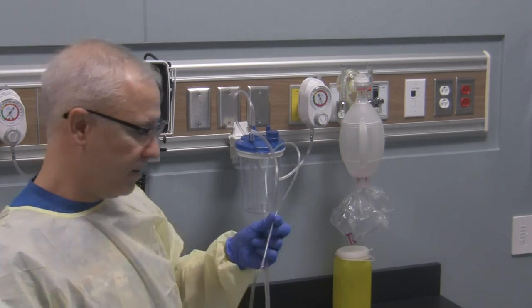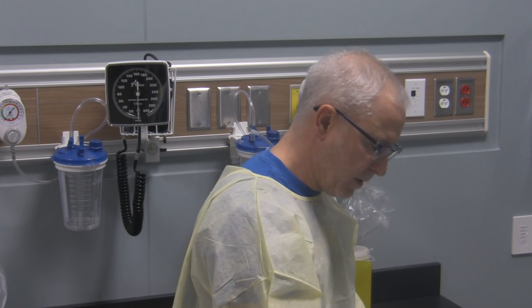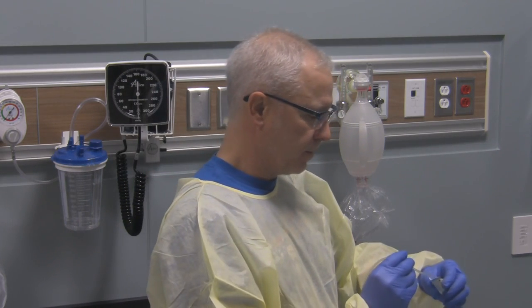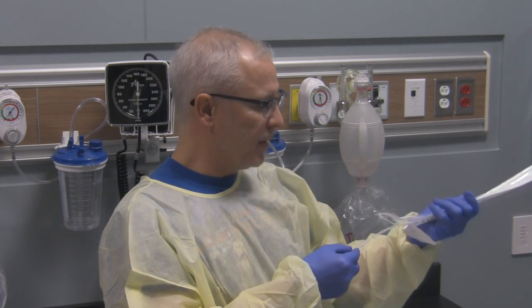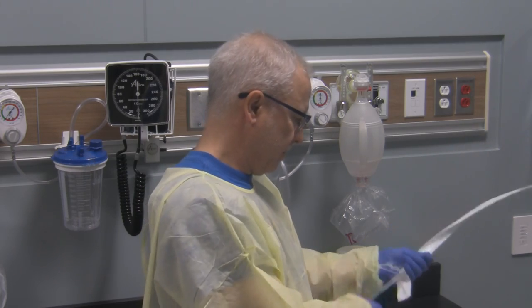Now I'm going to take the catheter out of the sheath and lubricate it with this mucogel. I'll open the mucogel and dip the end of the catheter into it — that's going to be my lubricant. It's now nice and lubricated. If I was going to use it right away I'd simply advance it into the patient, but I've got a little more prep to do, so I'll place it back inside the sheath for now.